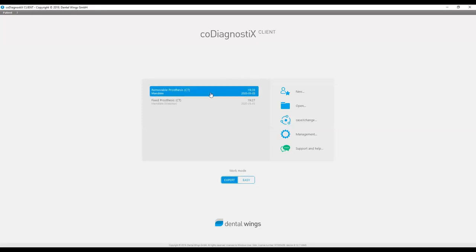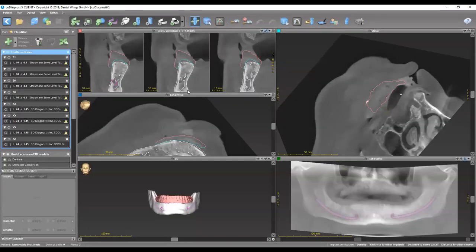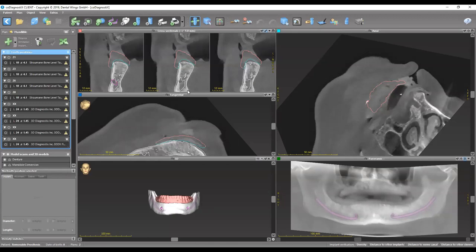We're going to be starting today with the plan for the removable prosthesis. According to literature, the absolute minimum would be two implants in the corner of the mouth at the canine sites, but that would be according to your preference as well. You can place two or more — four or five implants. According to Dr. Carl Misch, you can place three implants at sites A, C, and E: the canines (A and E) and C being the midline of the arch.